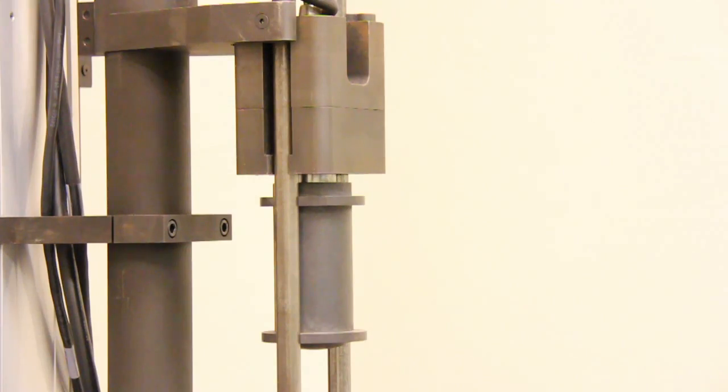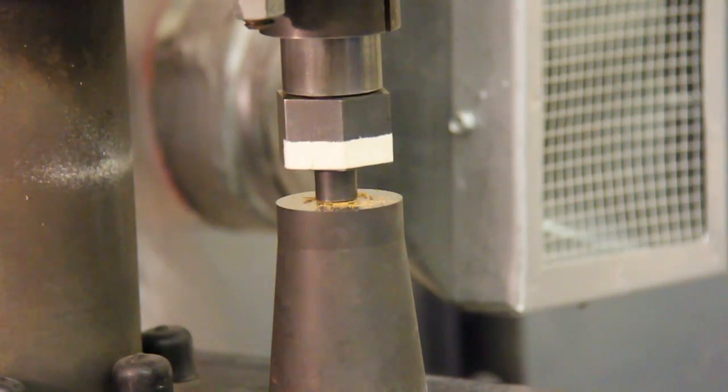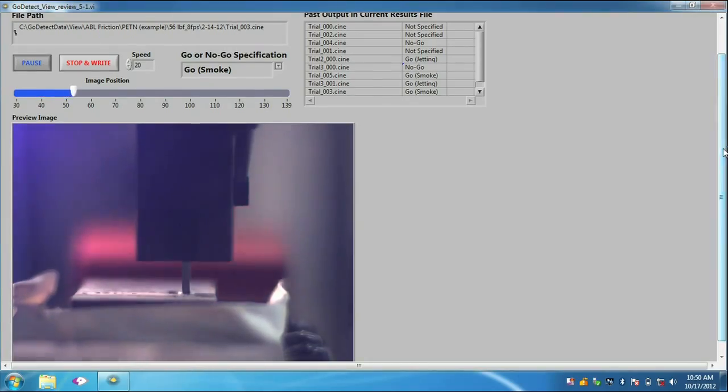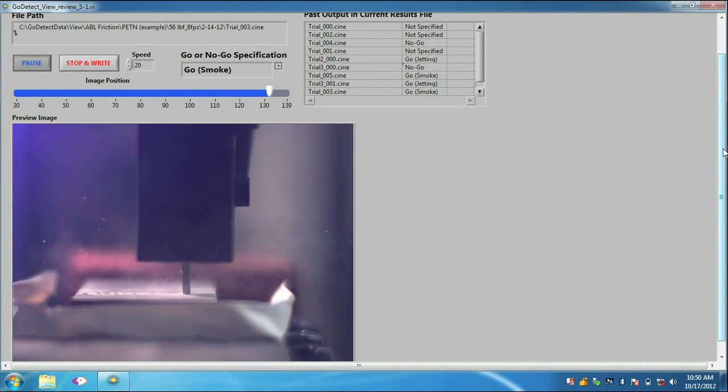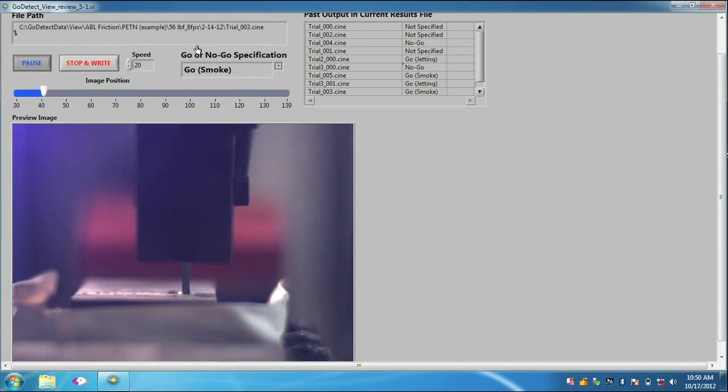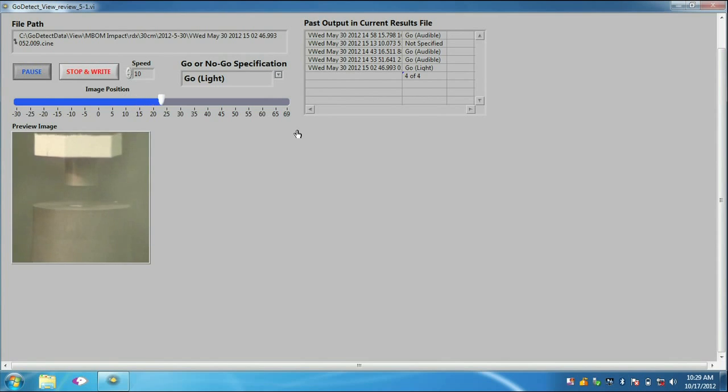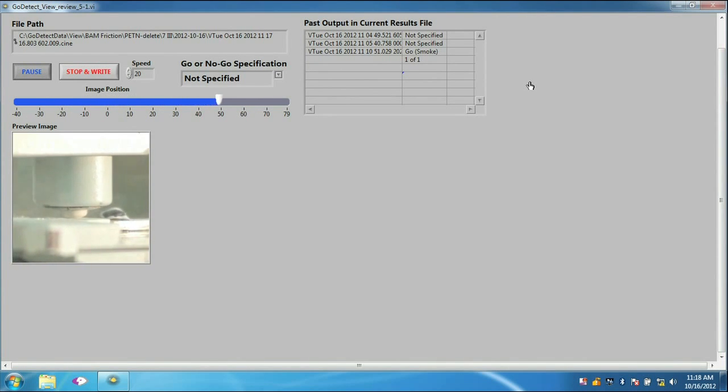After running the test trial, the GoDetectView software captures the significant frames, allowing unlimited and automatic playback to enable the operator to carefully determine whether or not a reaction has occurred. Once the user has determined the reaction, the software records the user's input and documents the reaction determination.